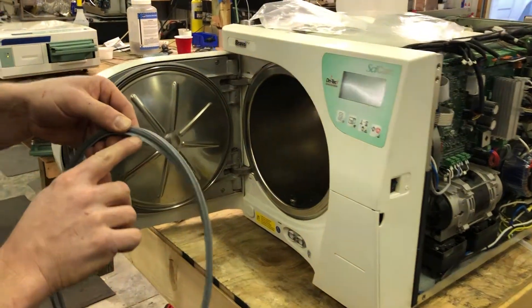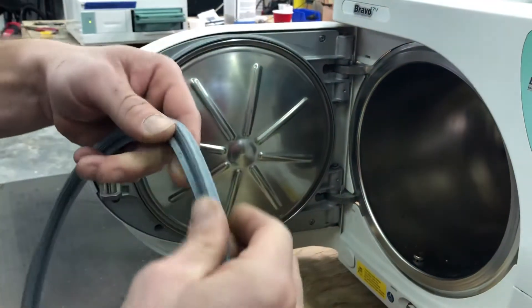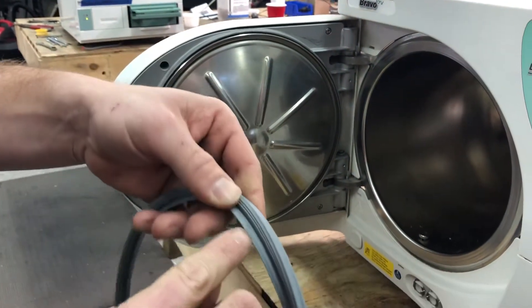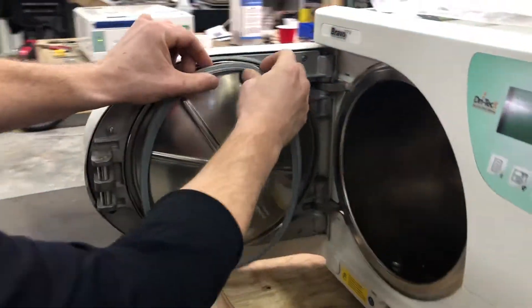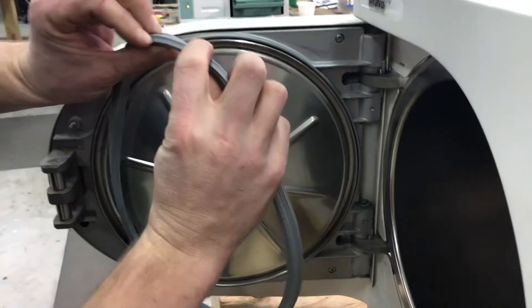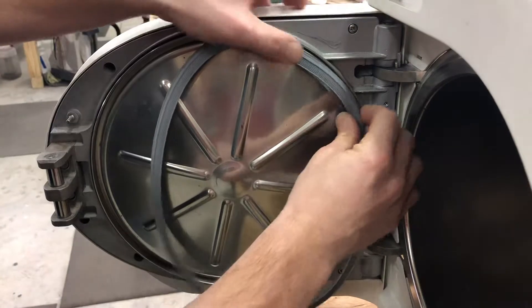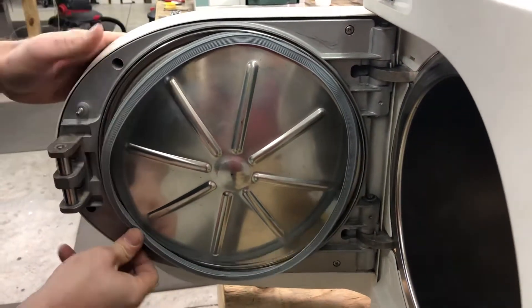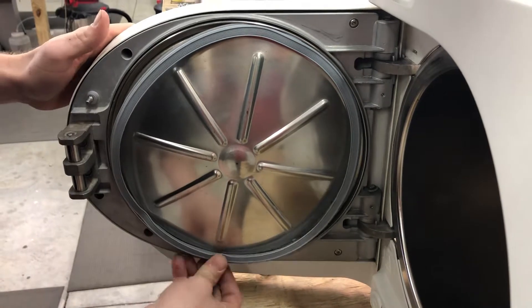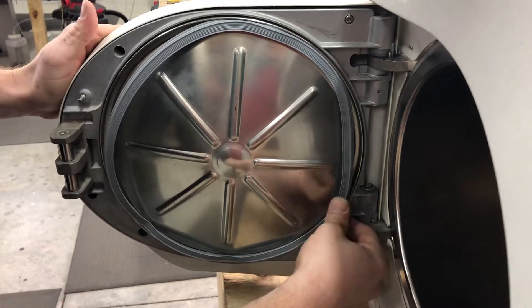If you look at the gasket, there's this little tab here — these little tabs — and they're all over the inside. Basically, what you do is you take the fat end and slide it up in here with that little hash or raised tab lined up there, and then you just put it in from there. Go down here, line them up. Here, line them up. Just push in like so.